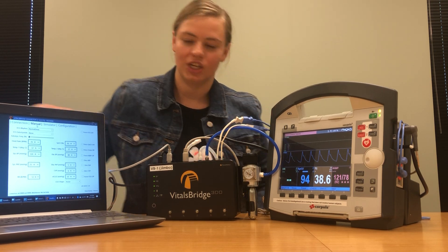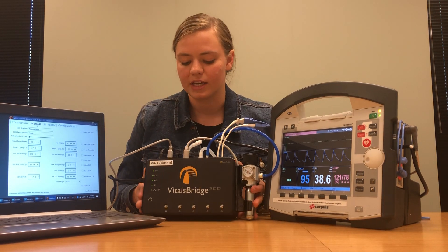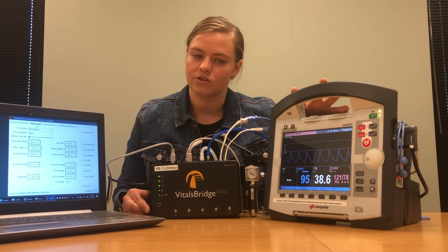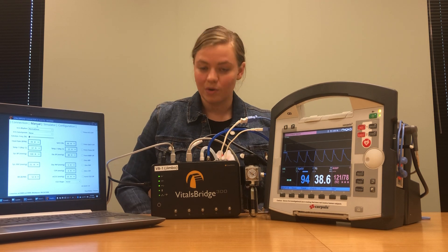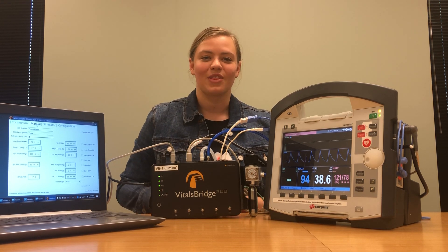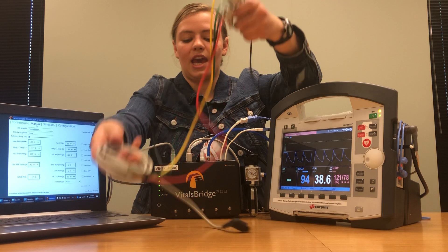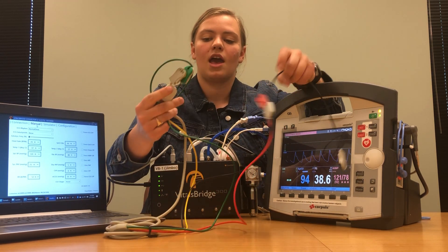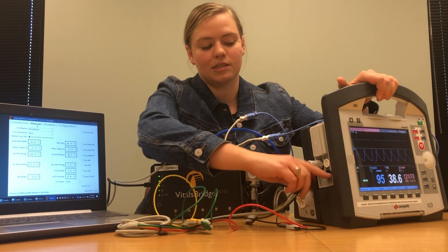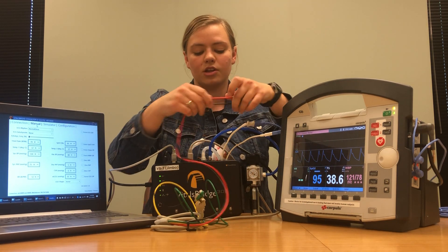The last thing we're going to connect is our ECG. Since the VitalsBridge is manufactured in the United States, the coloring system on our ECG buttons matches the US ECG cable coloring system, but the Core Pulse patient monitor is not manufactured in the United States so the colors will not match. If you'd like to know how different coloring systems match across countries, there are several tables you can find online. Your ECG cable has one end that plugs into the patient monitor and one end with all the ECG clips. Plug the monitor end in right where it says ECG.